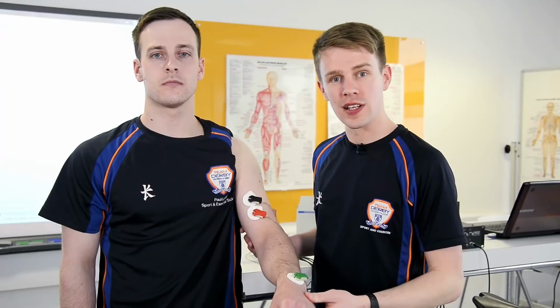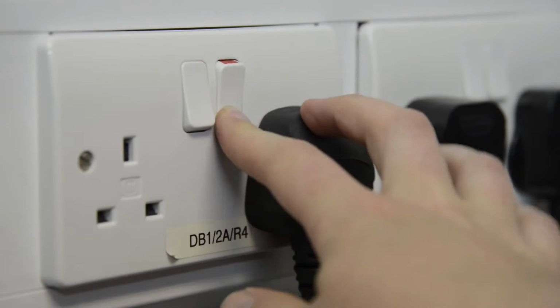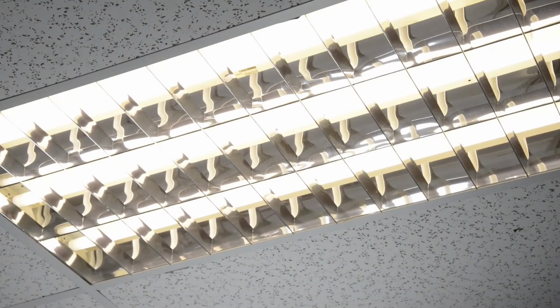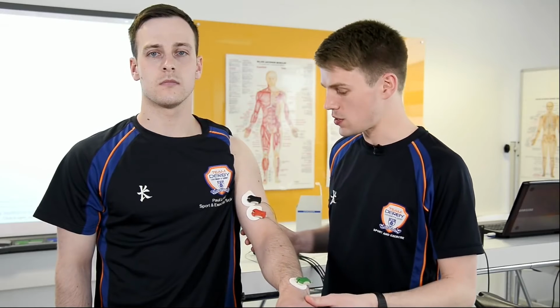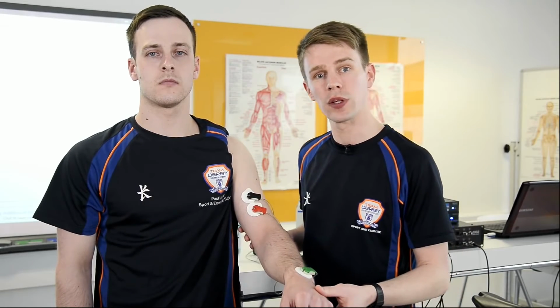The electrodes and wires are now in place to record from Paul's biceps muscle. However, there are other sources of electrical noise all around us. Power lines in the walls and ceilings, fluorescent lights and other pieces of electrical equipment all give out an electrical signal. Whatever the source of this noise, it's also picked up by our electrodes. However, this problem can be overcome by using differential recording.